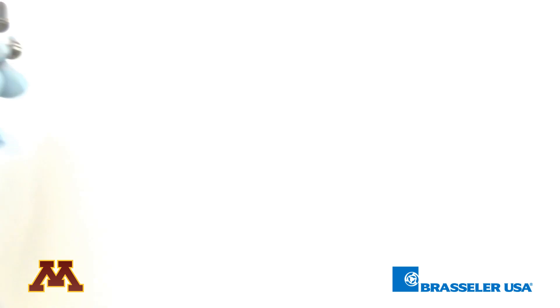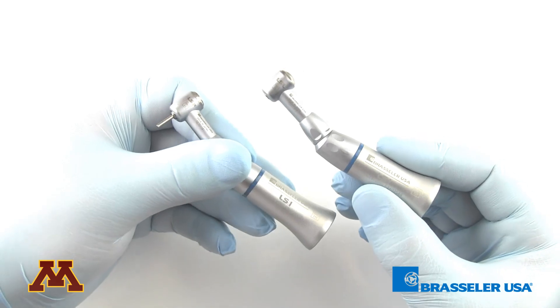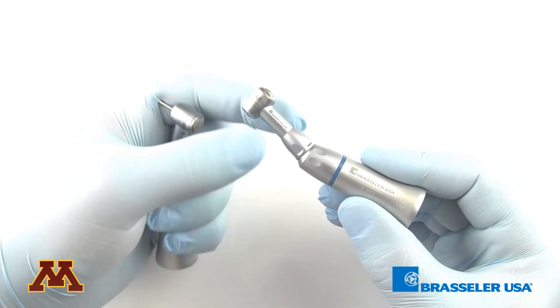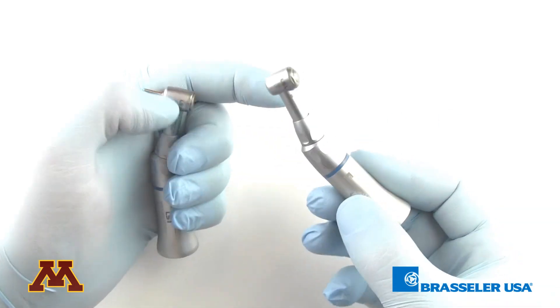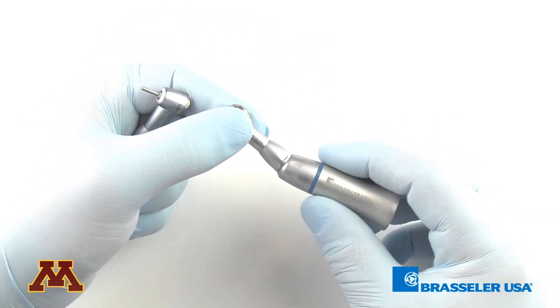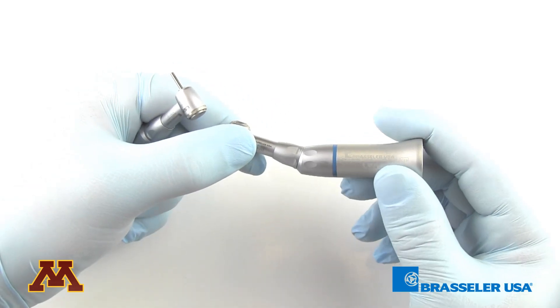As for the other low speed attachments, there's one dedicated to latch burs and one dedicated to friction grip burs. You want to be certain that you do not remove the heads from these sheaths. Everything comes together in a latch version and in a friction grip version — make sure that the head does not come off from the sheath.